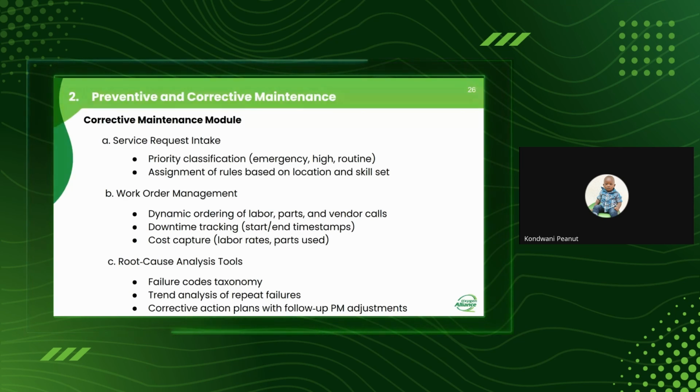Now, this system may be new to others, but we want to introduce a health passport to an equipment so that you can trace it from the time it enters into the service and the time it exits, like disposal.